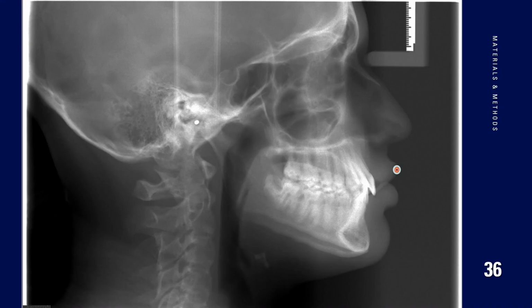Finally, the accuracy of the model was assessed in 3 different ways. So to compare the accuracy of the model to those in the literature, a successful detection rate calculation was included, as this is how most other models report their accuracy. So the percentage of the time the landmark was successfully detected in ranges from 1 millimeter to 4 millimeters were calculated. And here you can see the depictions of a 1 millimeter and a 2 millimeter radius for reference.